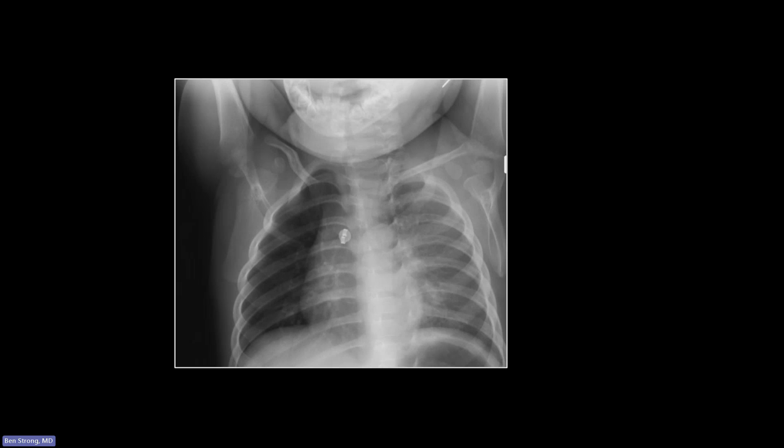An interesting thing about aspirated foreign bodies in pediatric patients is that you can either get hyperinflation distal to the aspirated body, or atelectasis distal to it. The inorganic aspirated foreign body is static in size and will not completely fill the bronchus during inspiration, when you typically have widening of the bronchi. This results in a ball valve effect that causes hyperinflation of the involved lung.